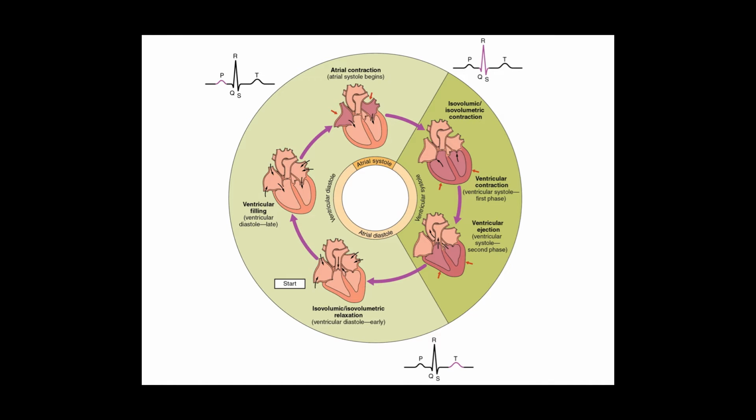In addition to ECG tracking, other clues can be employed to identify the end diastole and the end systole phases. In particular, the end of ventricular diastole is also marked by the closure of the mitral valve, which is followed by the so-called isovolumetric contraction and the opening of the aortic valve. The end of the ventricular systole is marked by the closure of the aortic valve, which is followed by the isovolumetric relaxation phase and the opening of the mitral valve.